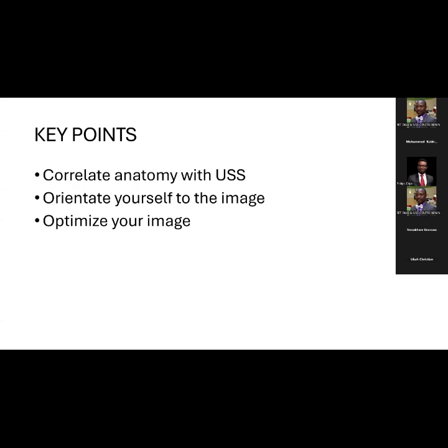You should also go to the left adnexal area sagittally and then turn to the coronal direction for you to be able to fan up and down to look for the ovary. Because most times you have to search for the ovary. It is when you still don't see it that you should aim for the vascular sign of the internal iliac. Then that will help you. Thank you. Yes.